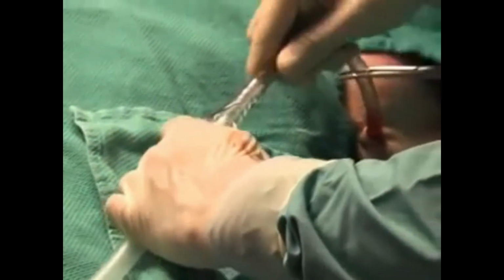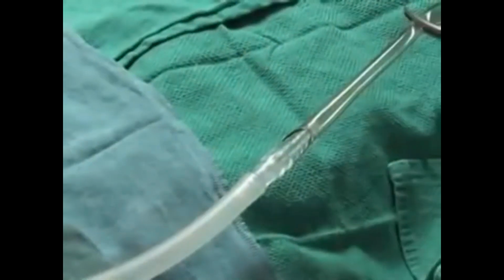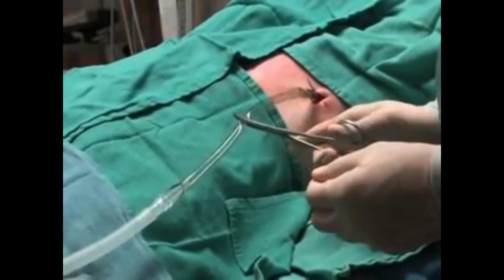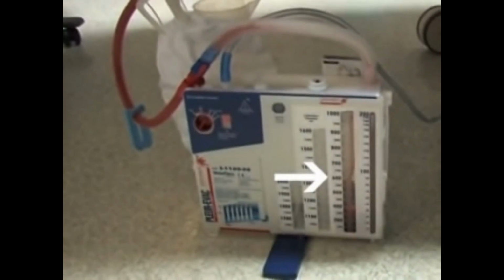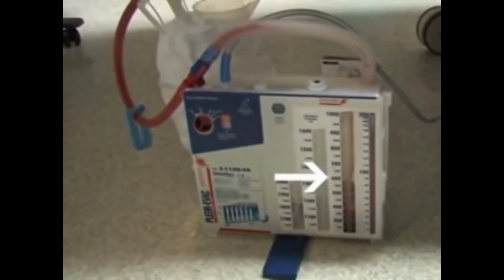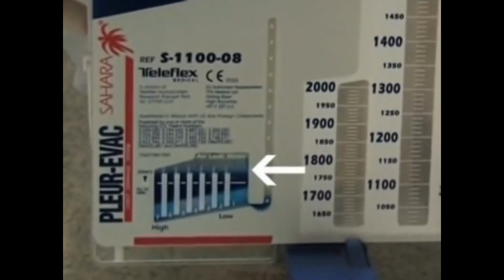Before unclamping the free end of the chest tube, firmly connect it to the underwater seal. Now unclamp the free end. If fluid is being evacuated, the fluid level in the drainage system will rise. If pneumothorax is being evacuated, air bubbles will appear.